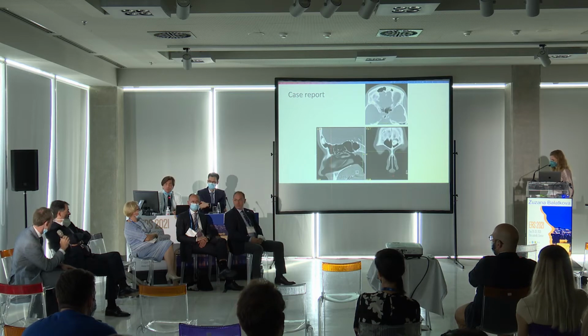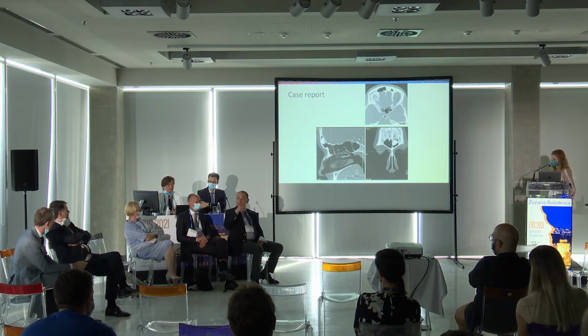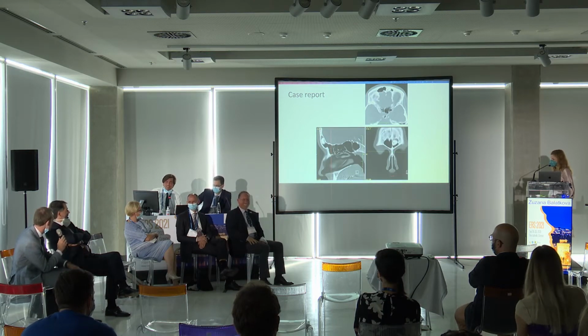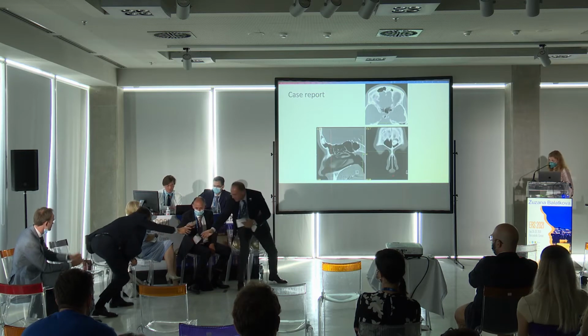But look at the attachment. And would you use a Draf 3 or Draf type B, C? I think you need a 3 eventually. Saves a lot of time. Or 2C. Well, that was my question, a 2C. For sure. You don't need to open both ethmoids for this stuff.